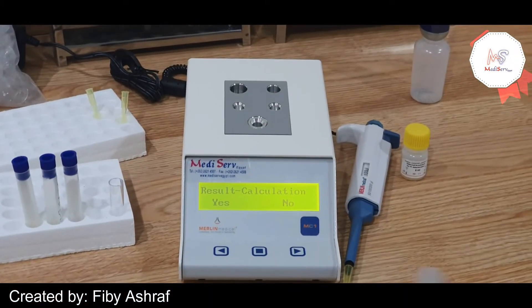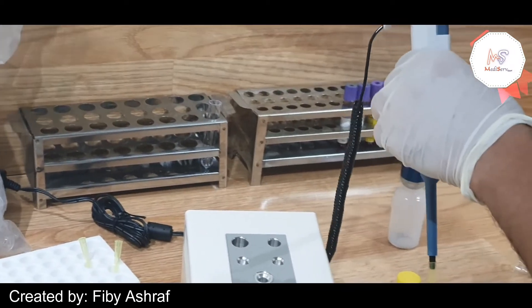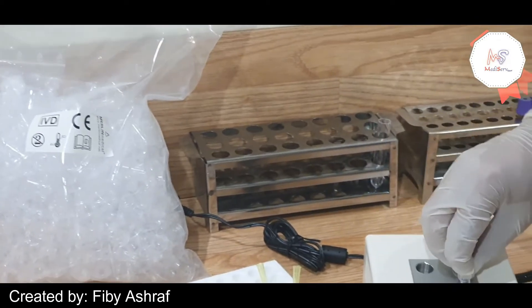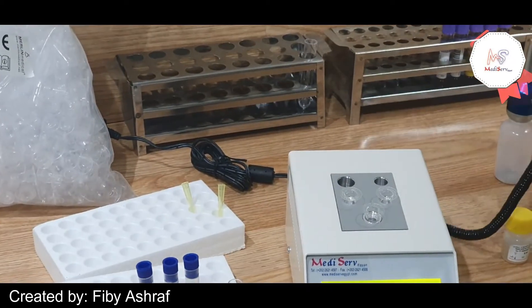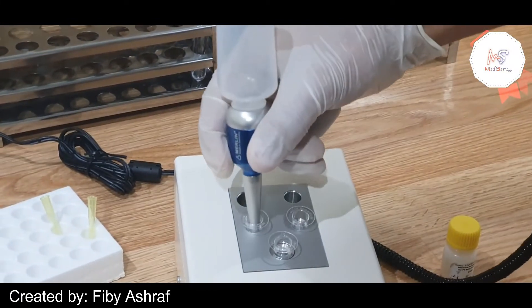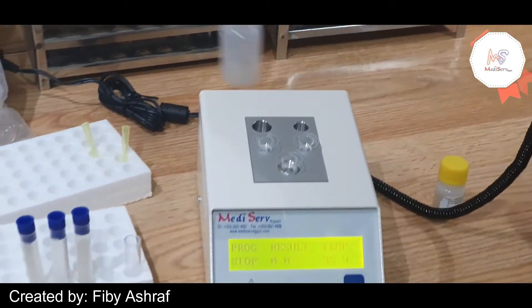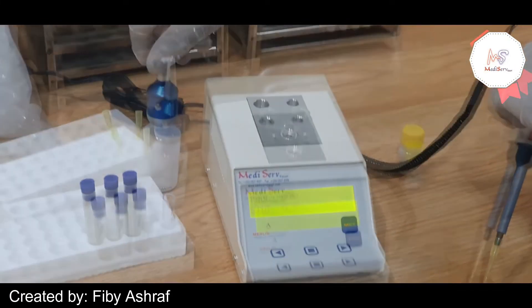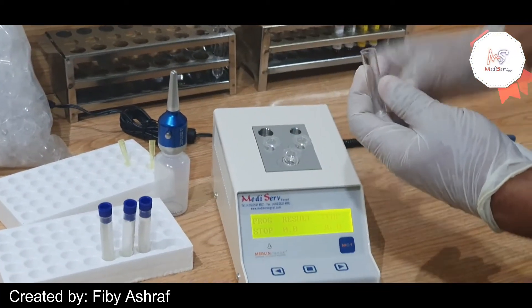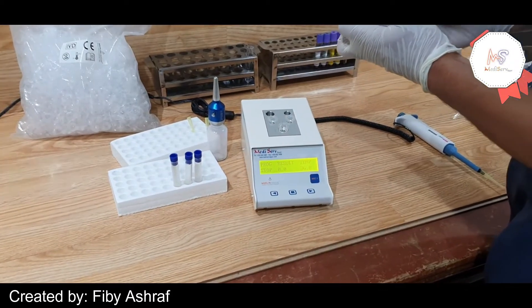After leaving MC1 to warm up, add the required number of cuvettes in the incubation area and dispense a ball in each cuvette. Then dispense a suitable amount of the reagent into a sampling tube and add it also in the incubation area.